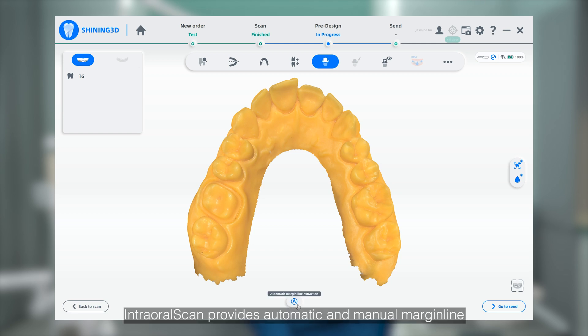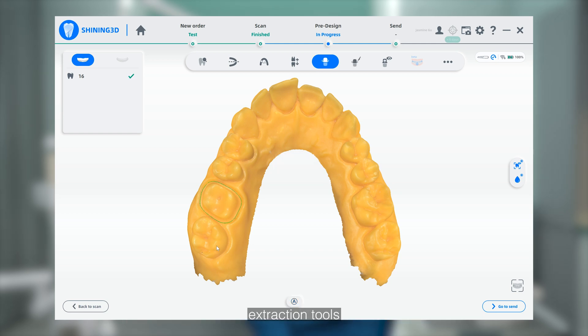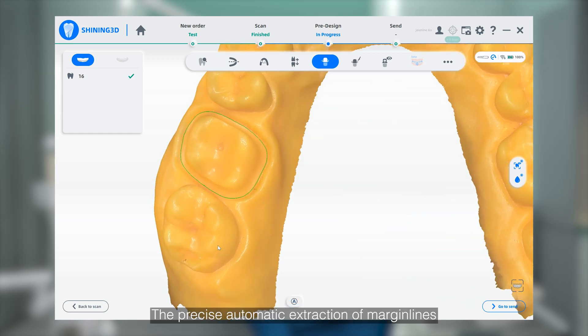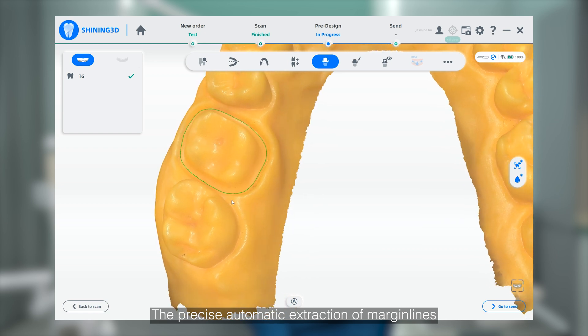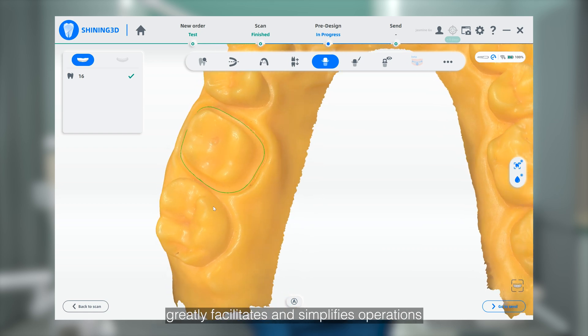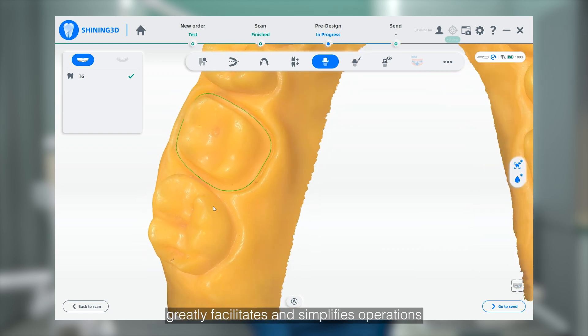Intraoral Scan provides automatic and manual Marginal Extraction tools. The precise automatic extraction of the Marginal lines greatly facilitates and simplifies operations.